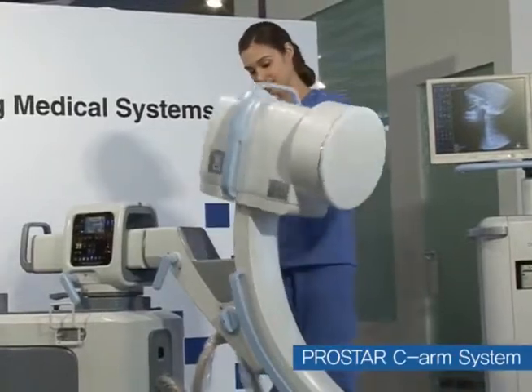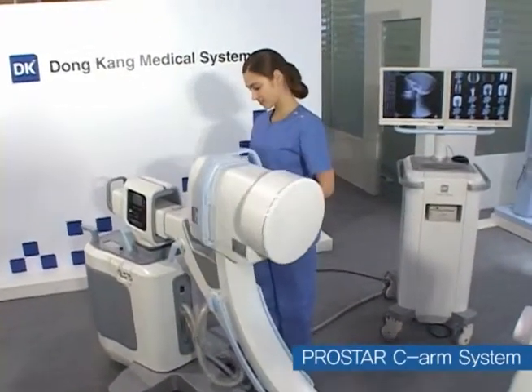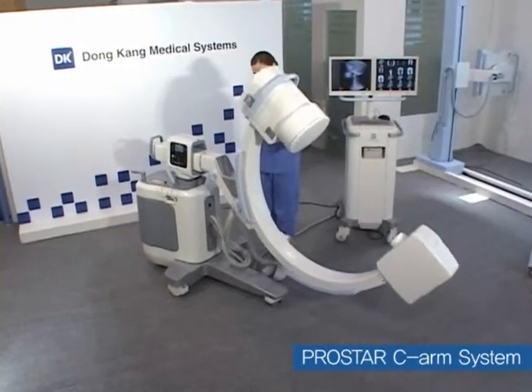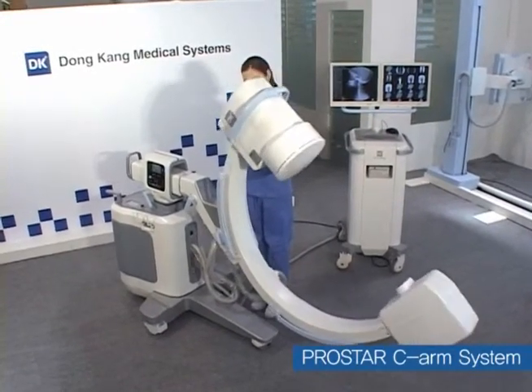The C-Arm of Dong Kang Medical Systems is a market-proven product in terms of design and performance, even compared to major global products, and is expected to substitute for imports especially in general hospitals nationwide.